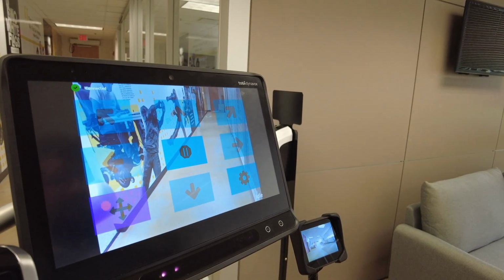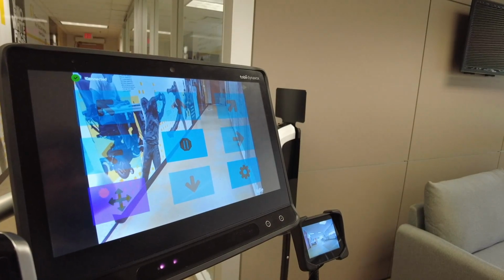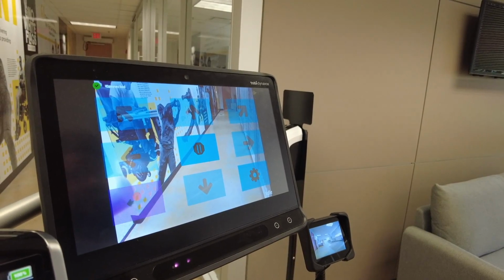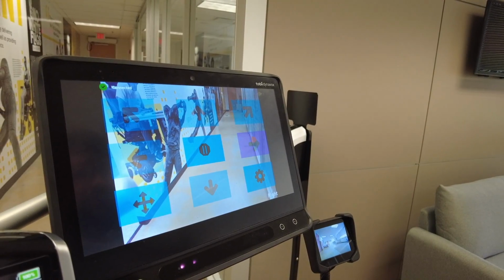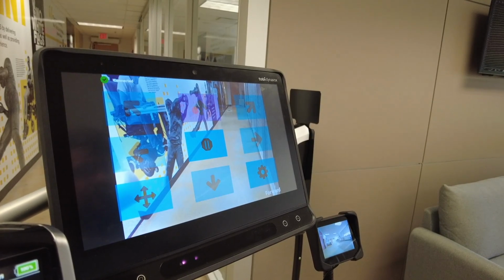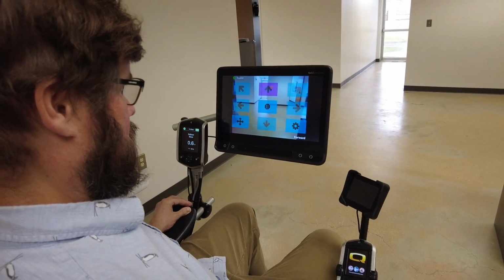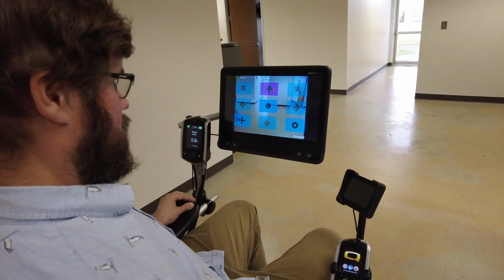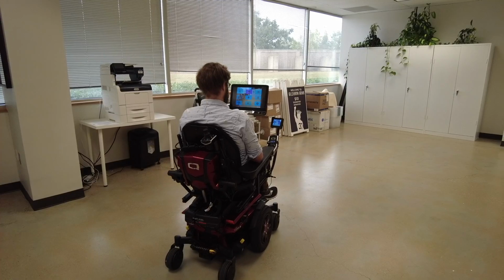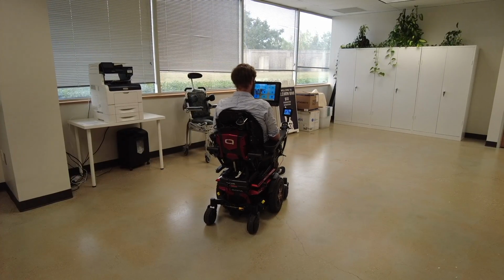When the application launches, the screen will display a live video from the front-facing camera of the eye gaze device. There will also be several buttons displayed over the image in a transparent blue. As you gaze at each button, it will change color, becoming purple. While the button is selected and turns purple, the system will be sending a command through the interface and to the chair. When looking at a stop sign image or not looking at a button, no command is being sent to the chair, and thus the chair will not move.